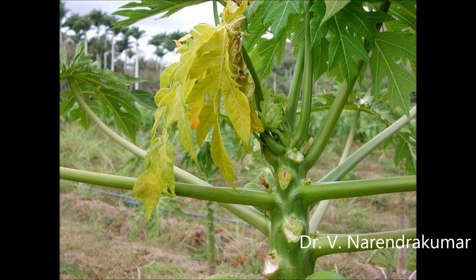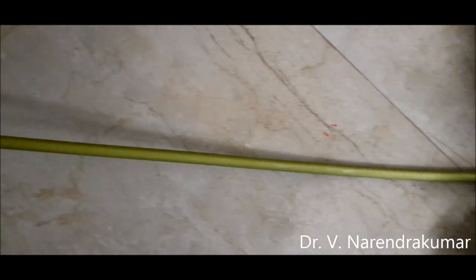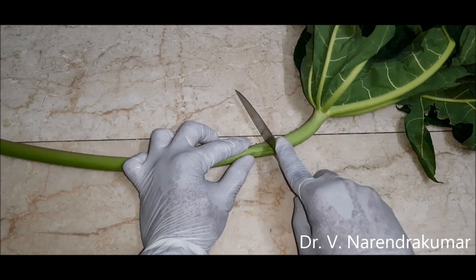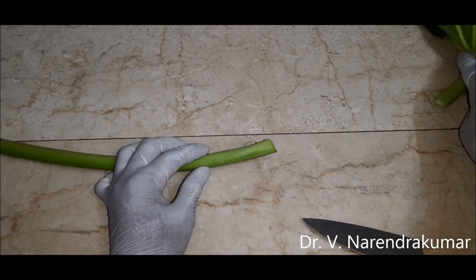These are the requirements. The main item needed is a papaya petiole, which is easily available. We don't need the leaf, just the petiole. So just cut at the front and you can remove the leaf.